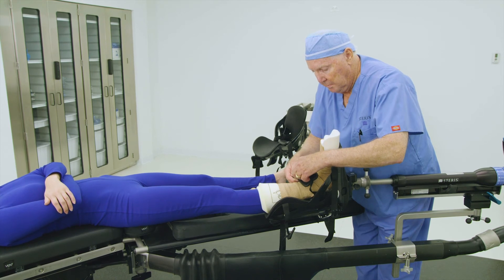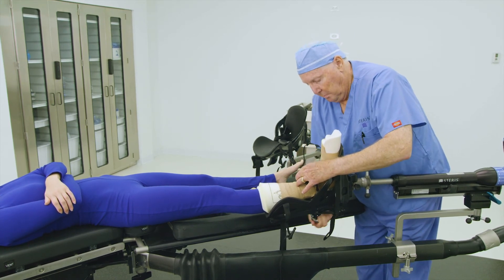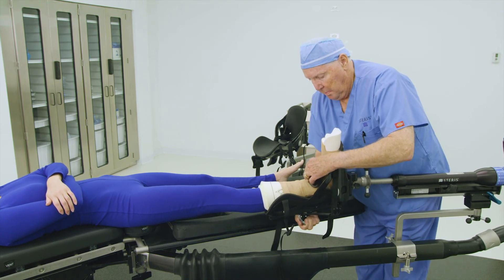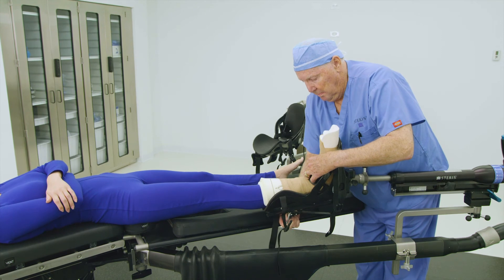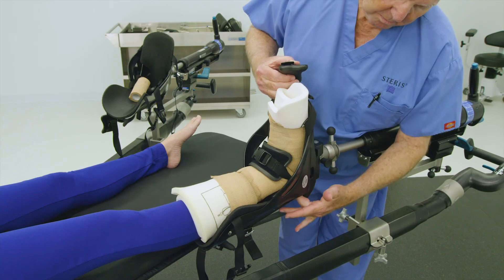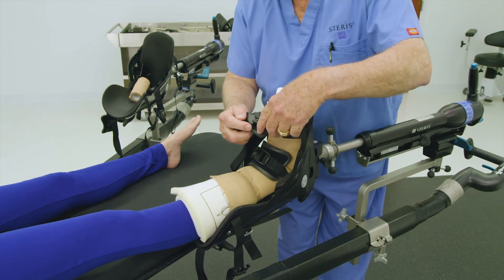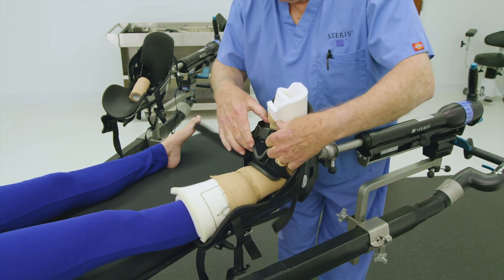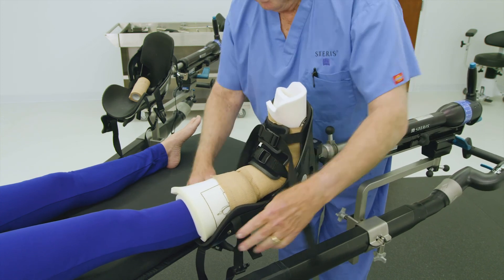Next, buckle the middle strap and ensure the strap is directly over the top of the ankle. On the underside of the boot, tighten the middle strap using the strap ratchet assembly until the ankle is secure. Finally, buckle the toe and calf straps and tighten straps securely. Ensure all buckles are centered. Failure to follow these steps could lead to the patient's foot slipping out of the traction boot.